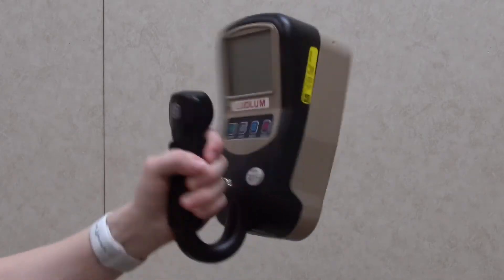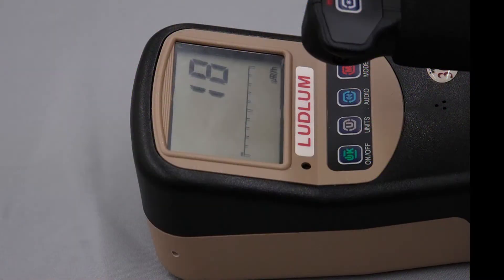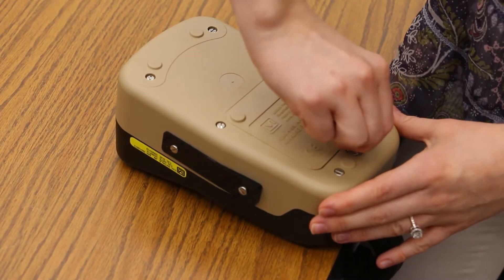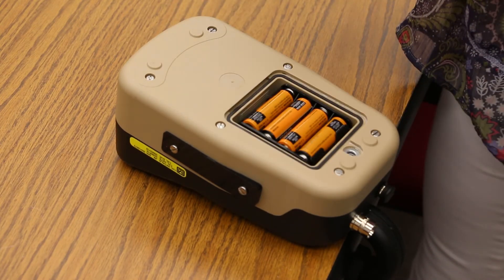The unit body is made of a lightweight but durable plastic. It is intended for outdoor use and can resist splashing water. The Model 3019 features a large liquid crystal display that will be automatically backlit if light levels are low. The unit is operated with four alkaline AA batteries, with a battery life of approximately 750 hours under normal usage.